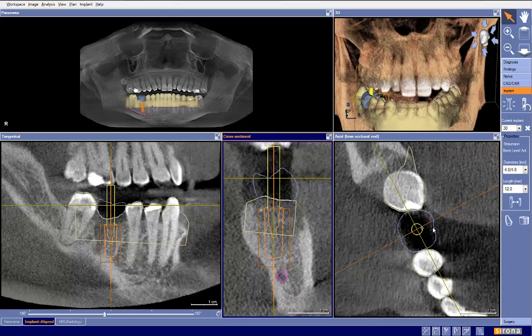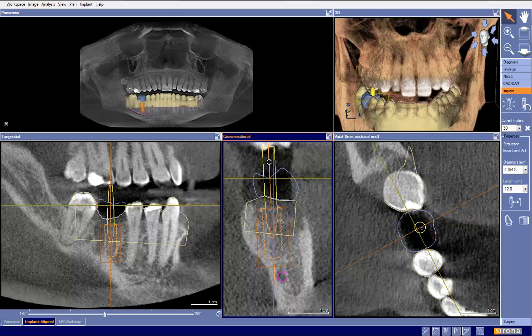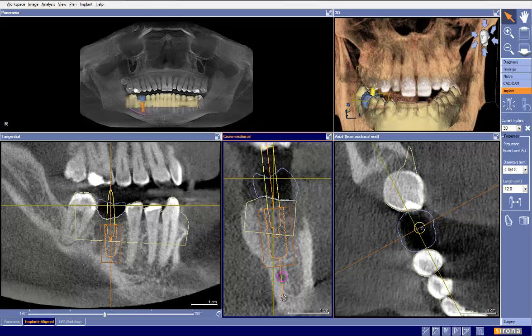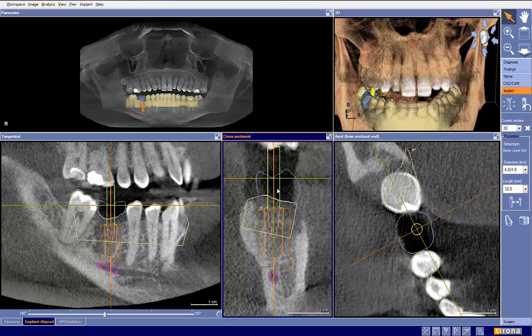Looking at this, while it looks like we're centered here buccal-lingually, what I'm really looking at is that posterior lower molars are tilted in to the lingual. So, our central groove — while we look like we're centered here — based on this design, is actually right here. What I would like to do is tilt this implant in to the lingual to get our implant lined up to the central groove. Rather than doing it from the platform, I'd like to do it from the apex of the implant, like so. By doing that, I not only get the implant centered nicely through the central groove, I also get away from that lingual concavity — that kills two birds with one stone.